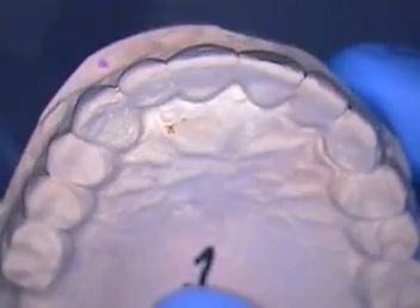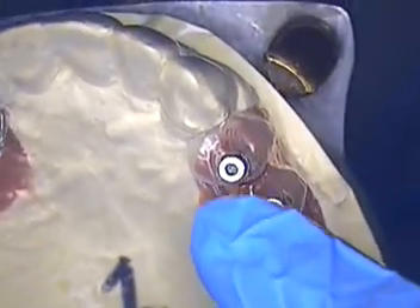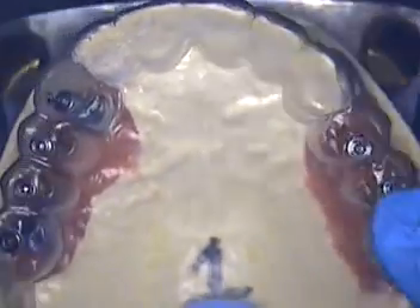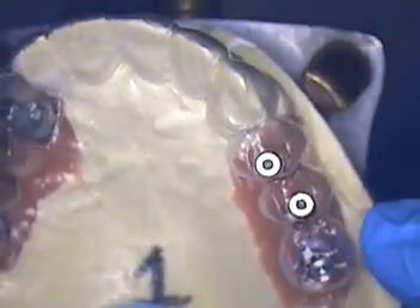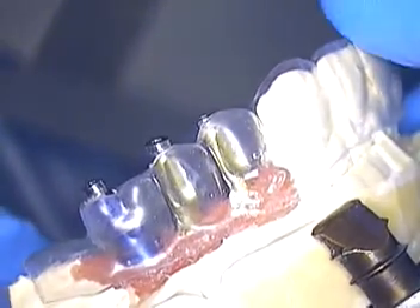For the upper, I went ahead and made a duplicate cast and then an OmniVac. Here's the dupe, and then we made a clear OmniVac suck-down to this. We also punched holes in areas where the excess holes would be, predicting the excess holes from the wax up. The upper right side looks somewhat better than the upper left side. The left side looks like they're all canted to the distal, and if you look from the side you'll see the implants go through more toward the distal on the upper left side.